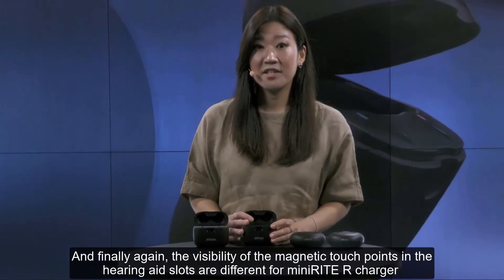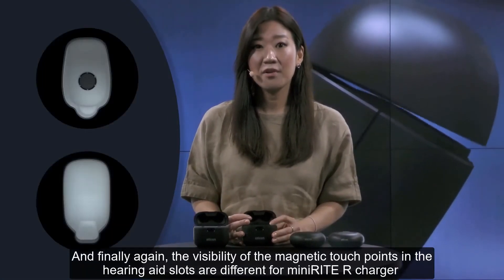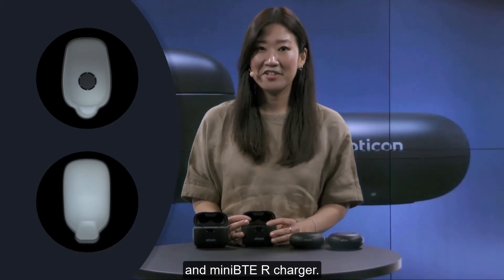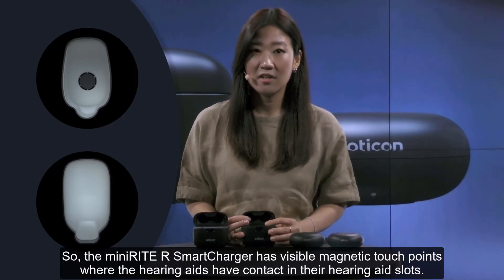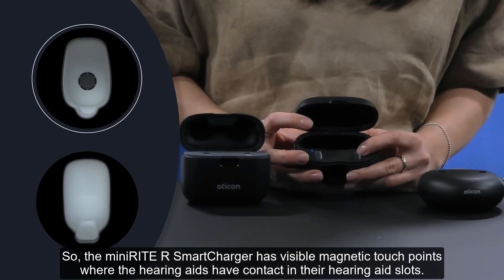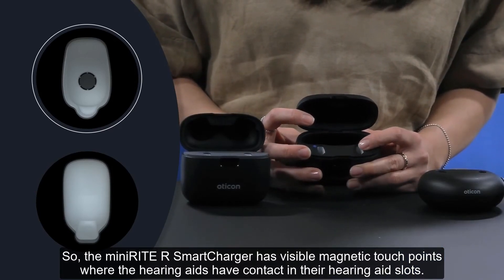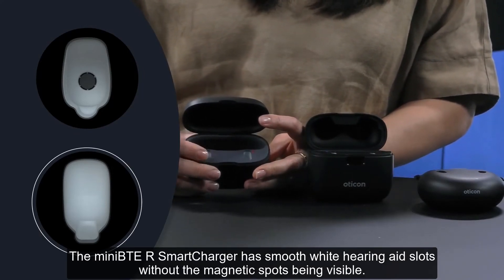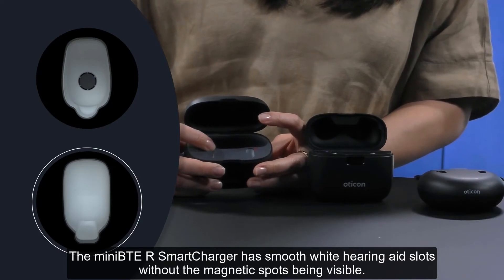Finally, the visibility of the magnetic touch points in the hearing aid slots also differs between the Minirite R and Mini-BTE R chargers. The Mini-BTE R smart charger has visible magnetic touch points where the hearing aids have contact in their hearing aid slots, while the Minirite R smart charger has smooth white hearing aid slots without the magnetic spots being visible.